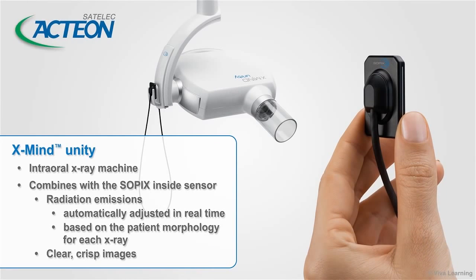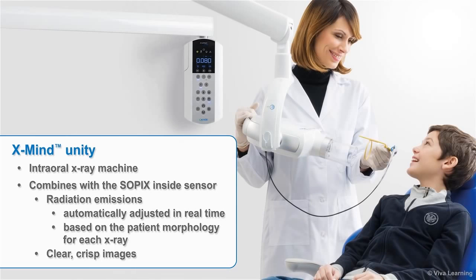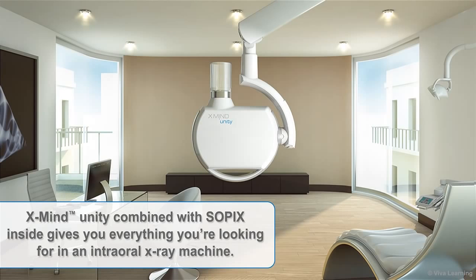With the XMIND Unity, Satellac, a division of Action Group, has created an intraoral X-ray machine that combines with the Sopix inside sensor to give you a host of benefits: radiation emissions that are automatically adjusted in real time based on patient morphology for each X-ray; clear, crisp images; an ergonomic design that provides stability and makes the equipment a pleasure to use; an intuitive control panel; and installation flexibility — all in an aesthetically pleasing machine that will look great in your clinic. XMIND Unity combined with Sopix inside gives you everything you're looking for in an intraoral X-ray machine.